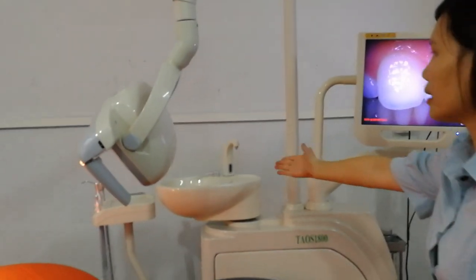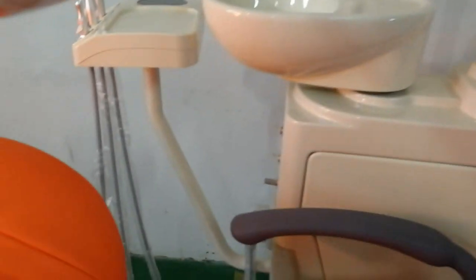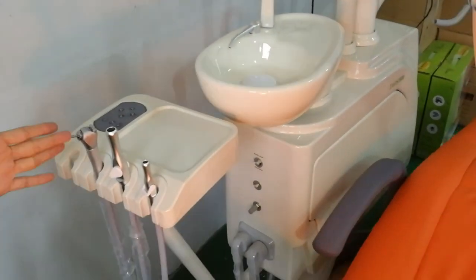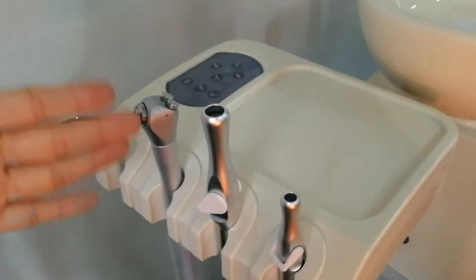This chair comes with a sensor. New design for the assistant tray. And this chair has one unique function — it is a built-in electric suction. It is direct, without a bottle.